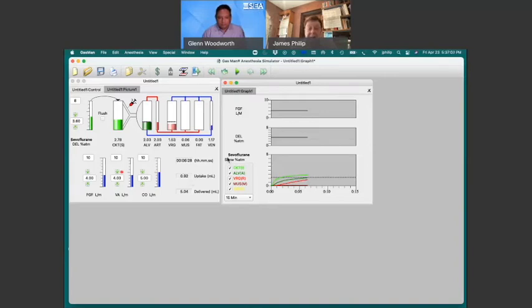But now it's time for us to say, Dr. Phillip, we've looked at the anesthesia monitor and it says that the end tidal concentration is 1 MAC. And the brain says, I'm not asleep yet. The anesthetic level in the brain still is a couple of minutes, probably about 3 minutes from there. So the brain will get there 3 minutes later. And those of us who think that we can track just our end tidal monitor are missing that part of the story. And that's in a different chapter later on.